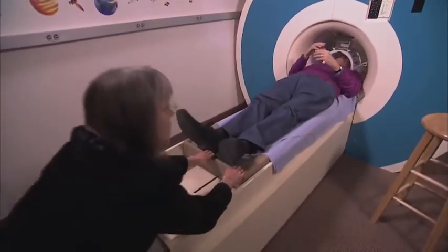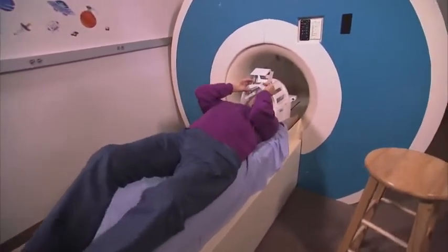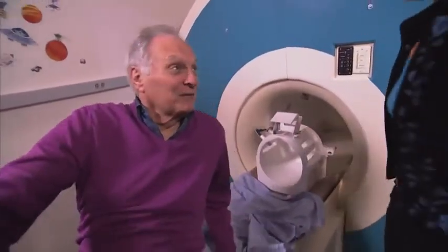Okay, Alan, we're done. I can take you out now. I tried out a fake scanner, courtesy of one of the world's experts in brain imaging, Nancy Kanwisher. That noise is very convincing. What is this? This is called a mock scanner. We use this because we scan a lot of children, and we want them to be used to the scanning environment.